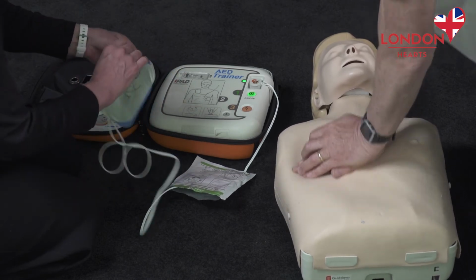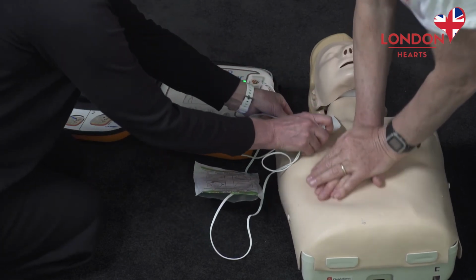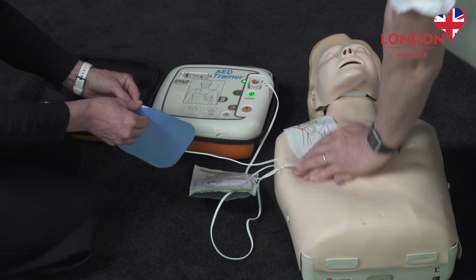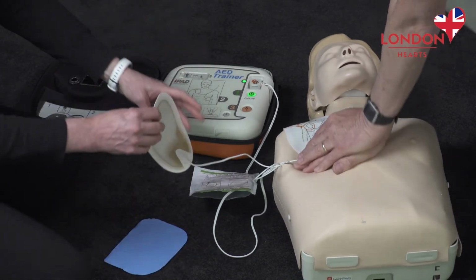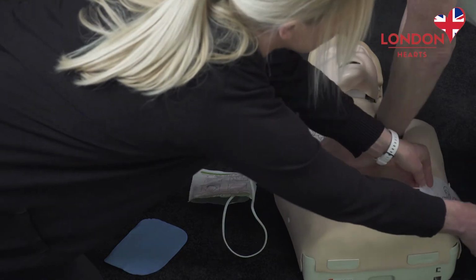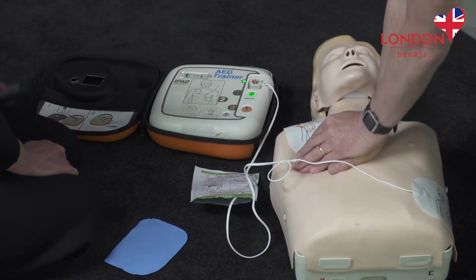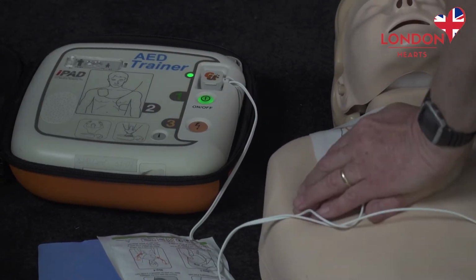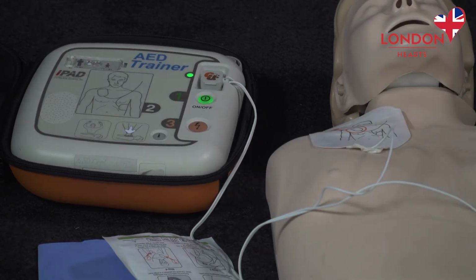Peel off the pad labelled 1 and stick to the bare skin of the patient, exactly as shown in the picture. Peel off the pad labelled 2 and stick to the bare skin of the patient, exactly as shown in the picture. Press the pads firmly to the bare skin of the patient. Do not touch the patient.